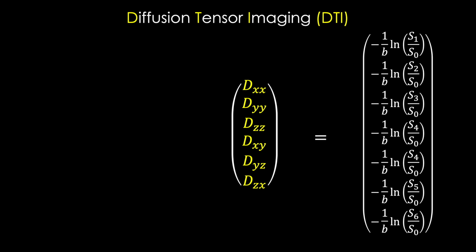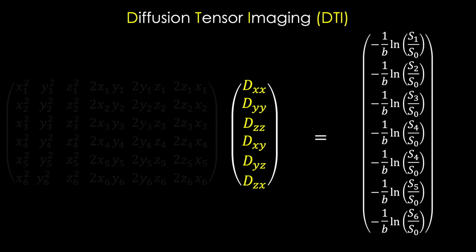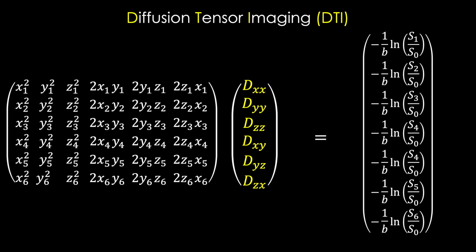This is still the signal of the image we generated after the sequence is run, so it's a known value, but you'll see here in a second why we label it this way. So while this seems like a natural evolution, the truth is the left side of the equation is not so simple. We are now describing not only the magnitude, but the direction associated with each. And as these are vectors that we need to describe in three-dimensional space, we need to introduce unit vectors as well as some geometry to the equation as shown. Yikes! Don't get lost in the math here.